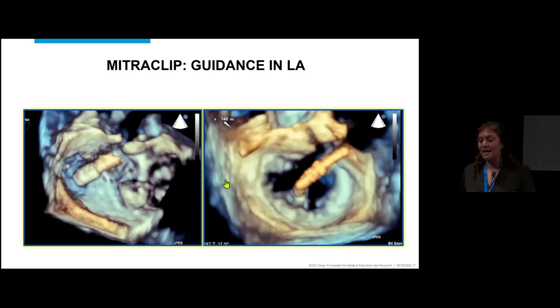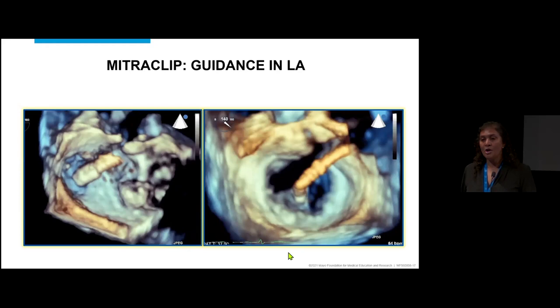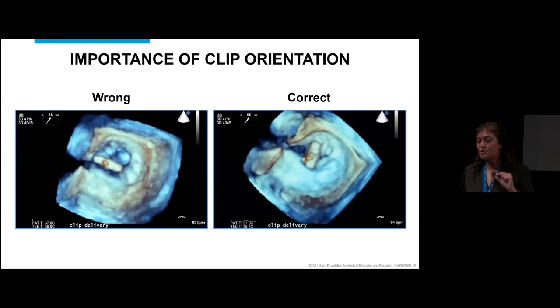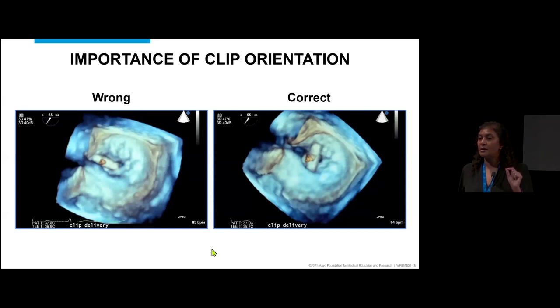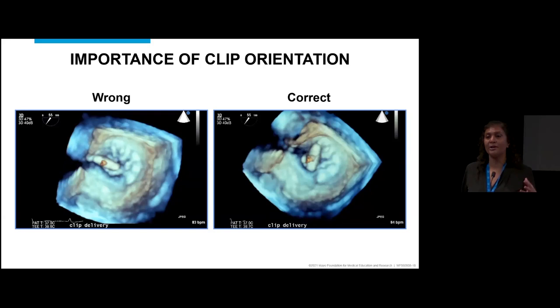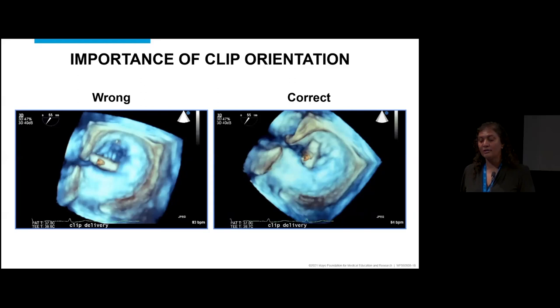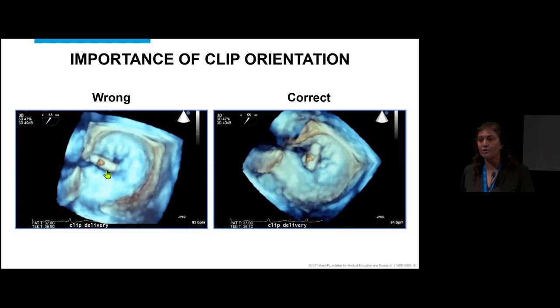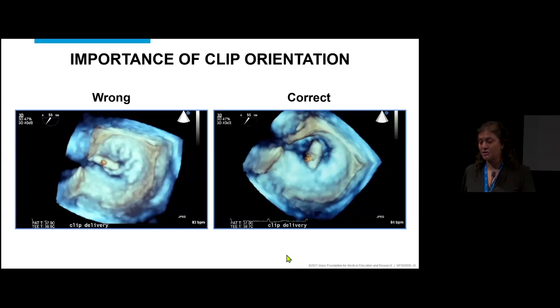We watch the clip coming down towards the valve and then through the valve. Positioning the clip with the right orientation is done entirely with 3D — this can really be missed on fluoroscopy alone. The heart is a three-dimensional structure, and big hearts especially may not reveal exact clip positioning on fluoroscopy. On 3D, we can tell if the positioning won't grab the A2P2 scallops and guide the operator to turn it to the appropriate position.